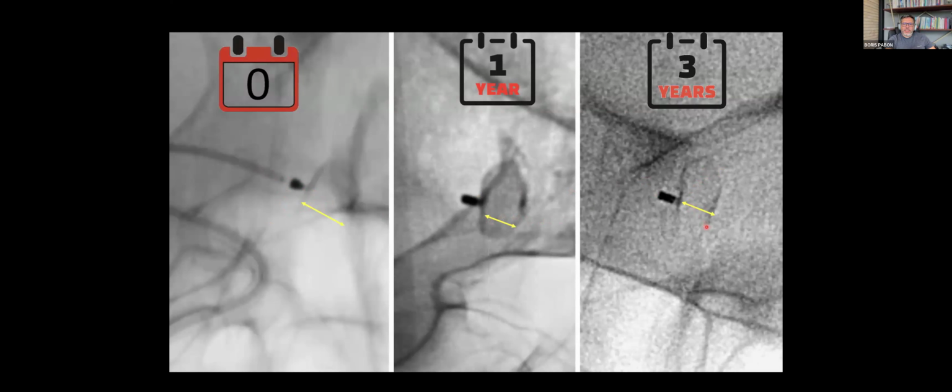We may identify some reduction in the device height, probably the same condition that we observe with the web, when both radiopaque markers try to get close.